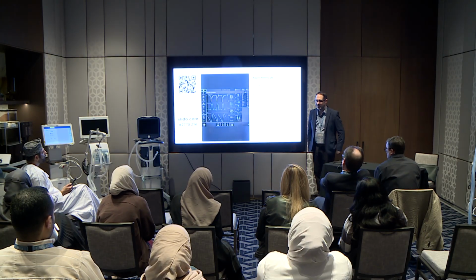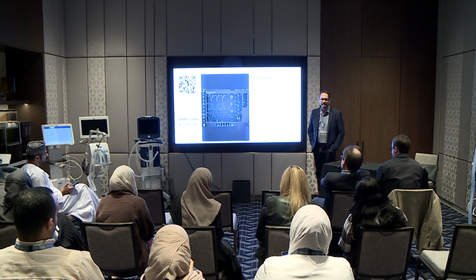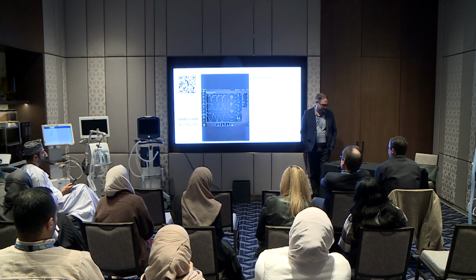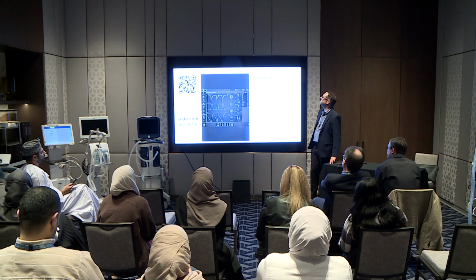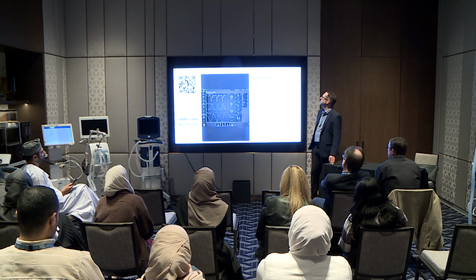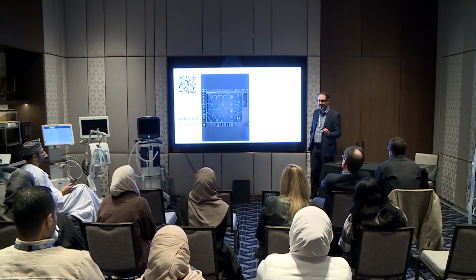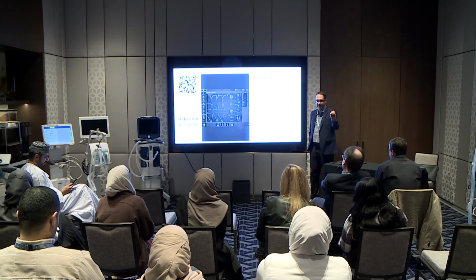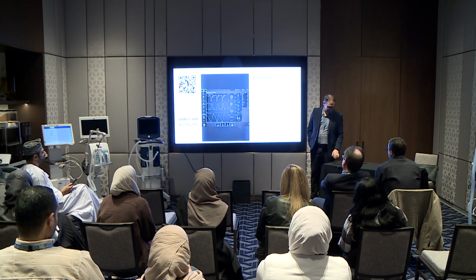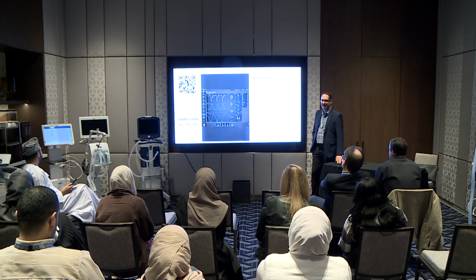Same patient. What would you call that? These are the 3 under assisted asynchronies that should go quickly. If anyone doesn't choose the right answer, I'm going to ask you to explain yourself because I want to learn so that I can explain better. I will not judge anyone, so if someone doesn't answer the right question, please provide me with feedback so I can teach better.